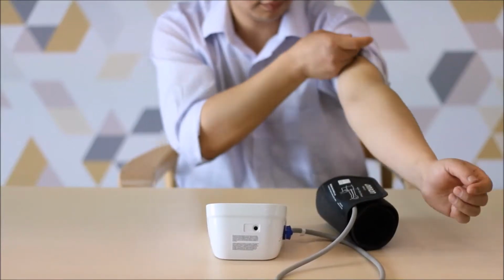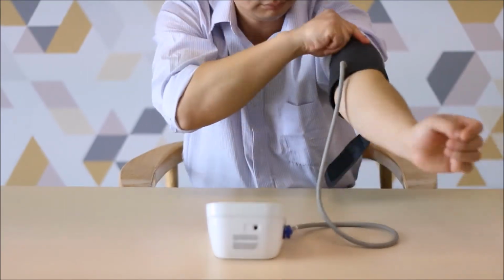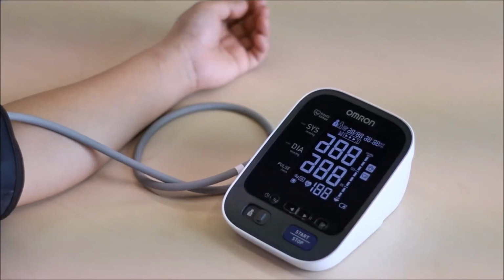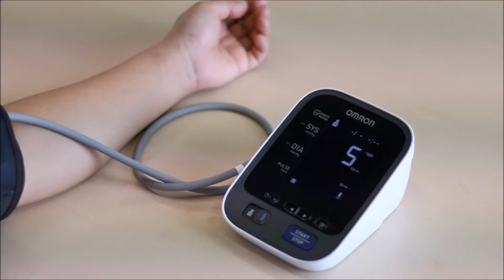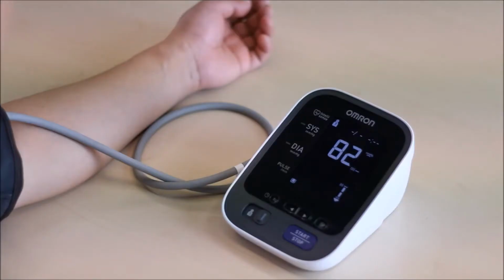Measuring blood pressure is a critical part of managing a wide variety of health conditions. That's why doing it accurately is so important. One factor that affects accuracy, and is often overlooked, is the performance of automated blood pressure monitors on individual patients.